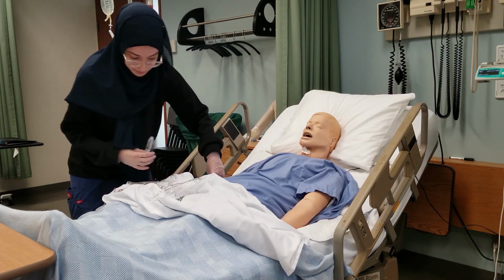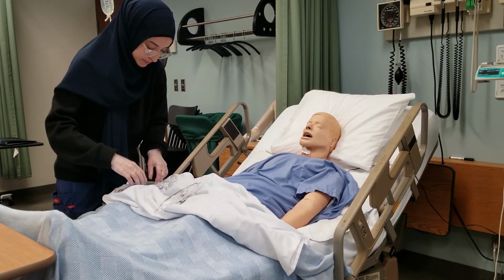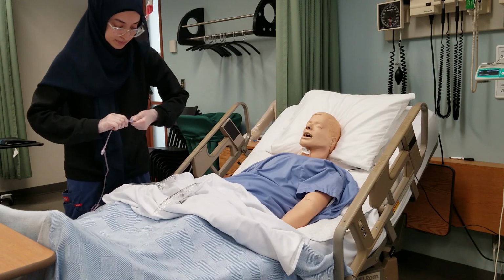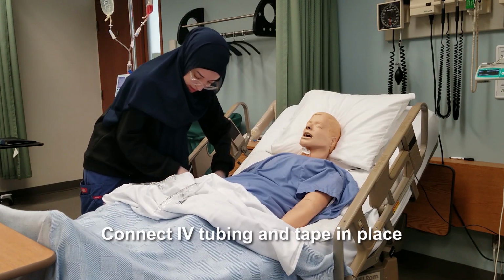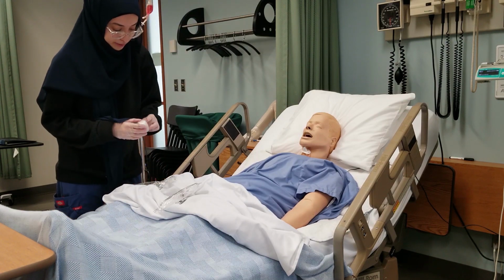Perfect. That's all done. So now I'm going to go ahead and connect your IV. I'm going to just tape it down, that way it doesn't bother you.